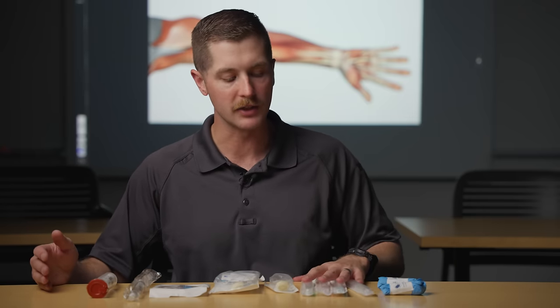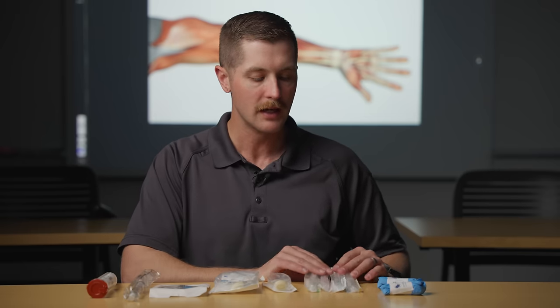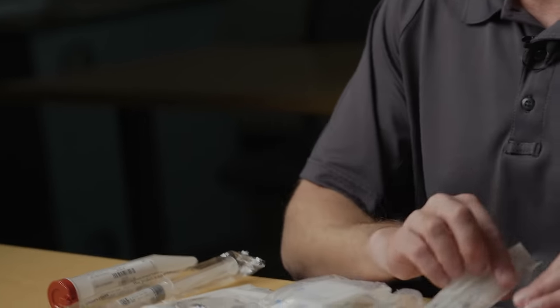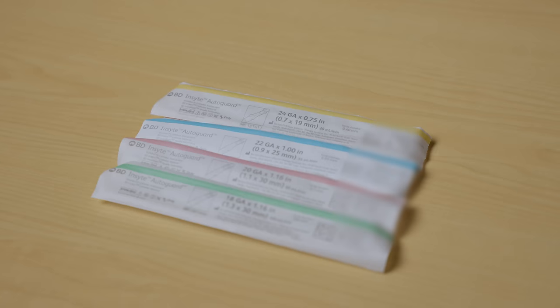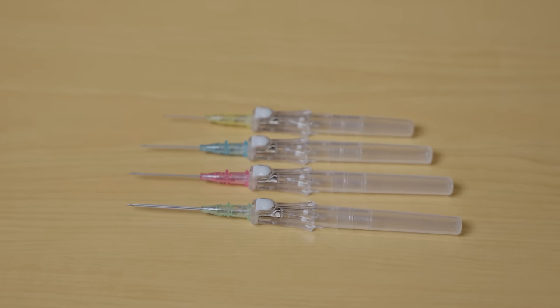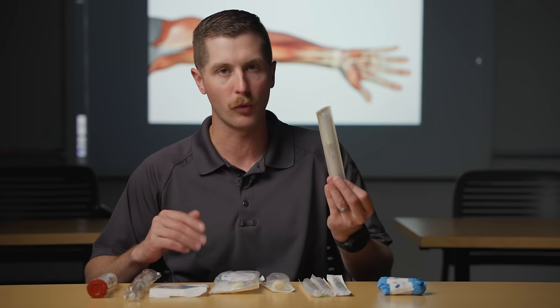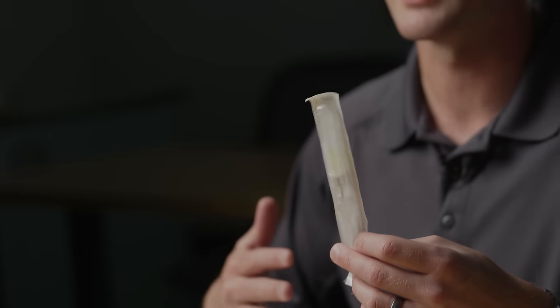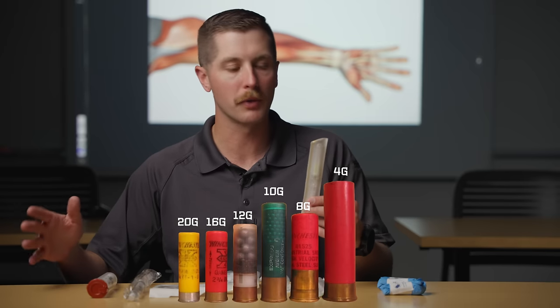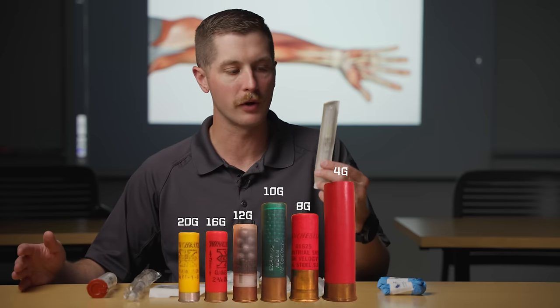Next up we have the IV catheters and these come in a variety of sizes. They are all color coded and those colors are pretty universal across healthcare, at least in the United States. So here we've got yellow which is a 24 gauge. You can think of these like shotgun cartridges — the smaller the number, the larger the catheter. So 24 is very, very tiny.